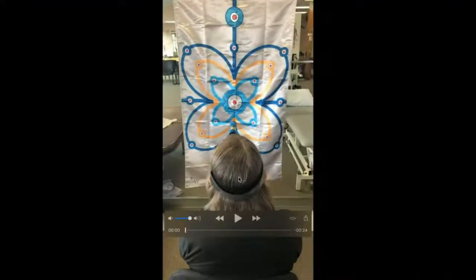So the setup here, let's go over this first. She's 5 feet away from the target. That's how I standardize everything in clinic now, because our Maze motion guidance flag is set up for joint position sense error testing at 5 feet. That was a previous live stream that we talked about, and that information can be found in our YouTube videos, Vimeo page, things like that. So she's 5 feet away.